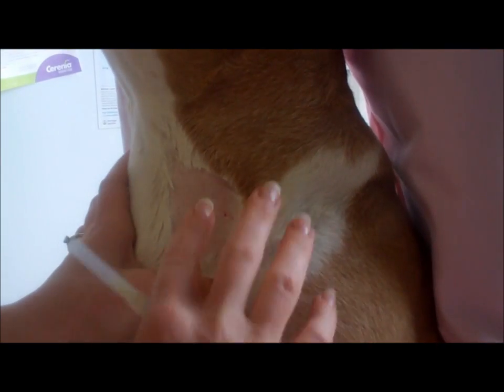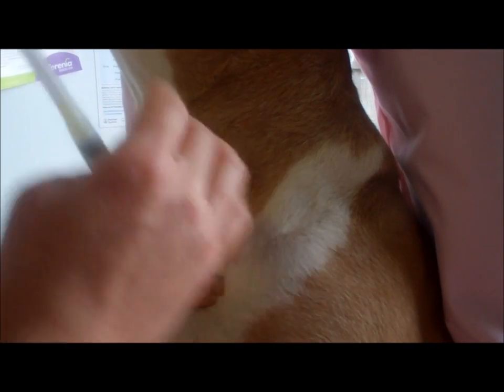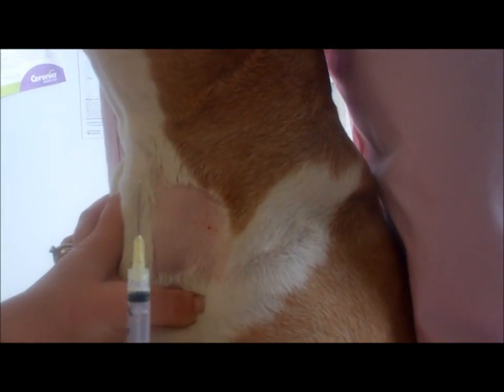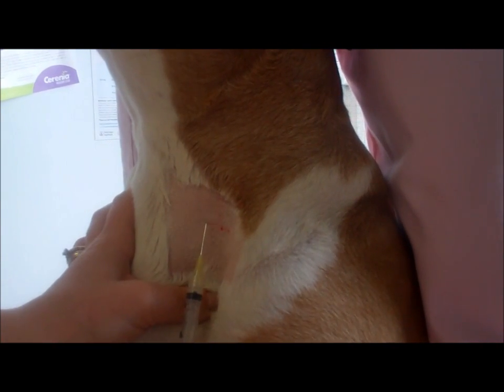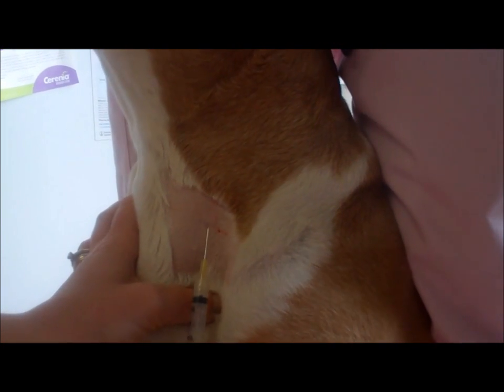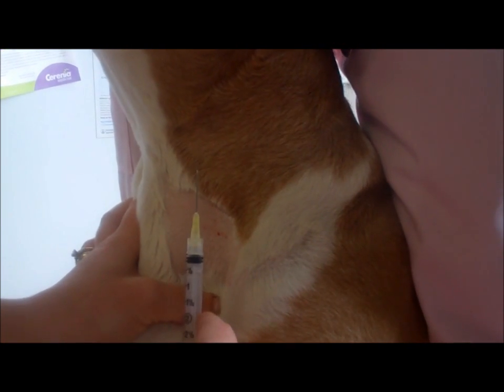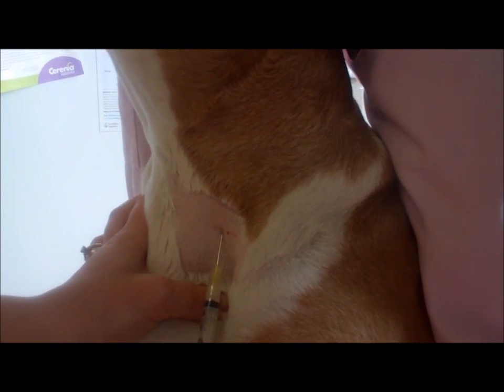Once you have located the jugular vein and feel comfortable about where you're going to place your needle, you always uncap with your fingers, not your mouth. You want your bevel to be up, and you go in parallel to that jugular. You want a nice smooth stick. For jugular draws, you'll be using a 20 gauge needle — that's the appropriate size.